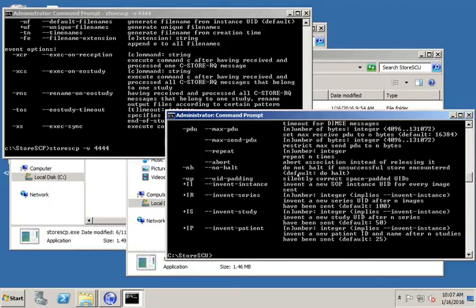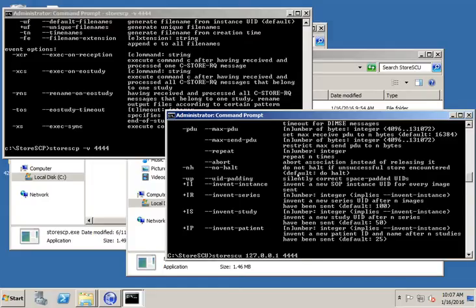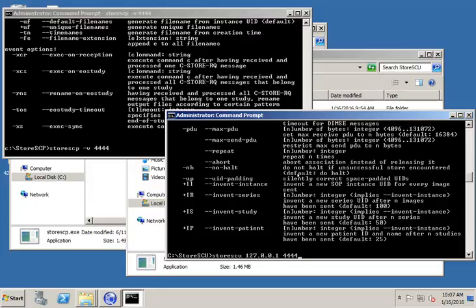So now I'm going to run the storeSCU command. And once again, if you just run the command, it'll show you the options. I know that the options that I want to run are, actually we're not going to run any options this time. I'm just going to pass it a file name and see if it'll send the file. So I know the IP address I want to send to is 127.0.0.1, and my port number is 4444. By the way, I'm using 127.0.0.1, which is the local loopback. That always works when you're sending to the same machine. But I could just as easily put the real IP address of my machine. That would work as well. And if I were sending to a device on another machine, of course I would have to put the other machine's IP address in there.